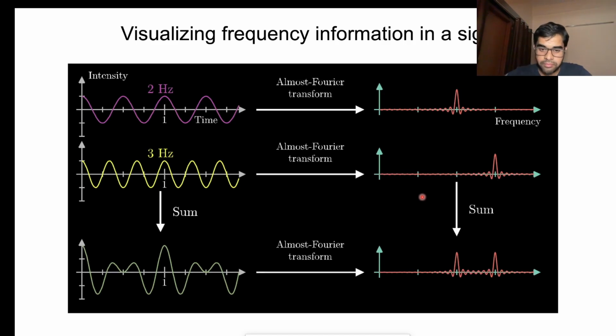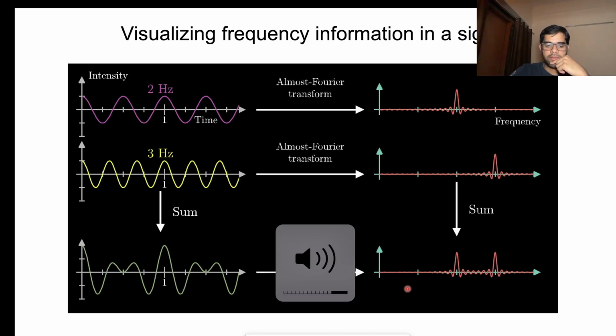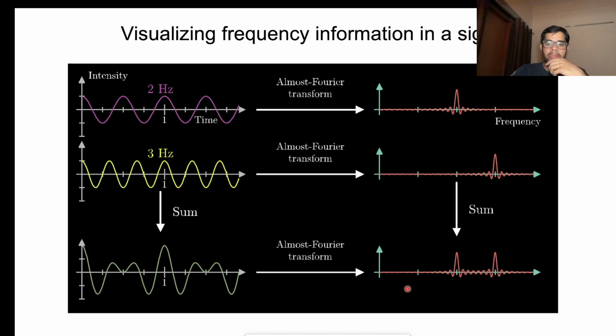My add-on to that answer is regarding neural oscillations. These different frequencies are hypothesized to play different purposes in brain activity. Especially studied in sleep, but also in awake periods they play different roles, and they can be modulated by some external stimulus, or by other perturbations that are not stimuli. We can see a signal, and then if you present something, you can see which kind of frequencies are going up or which are going down.